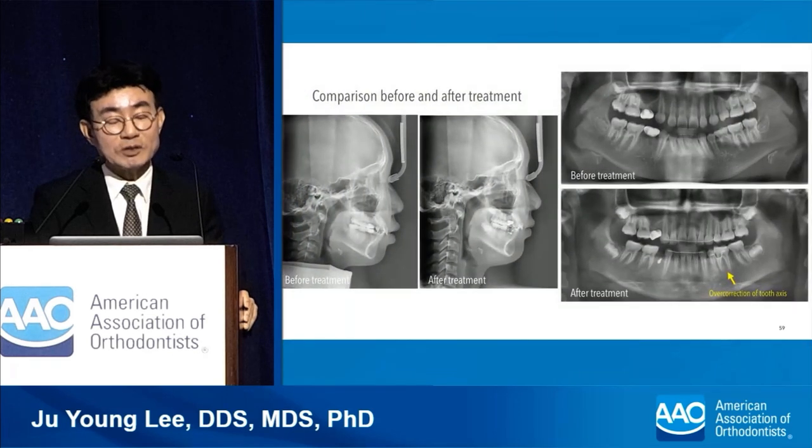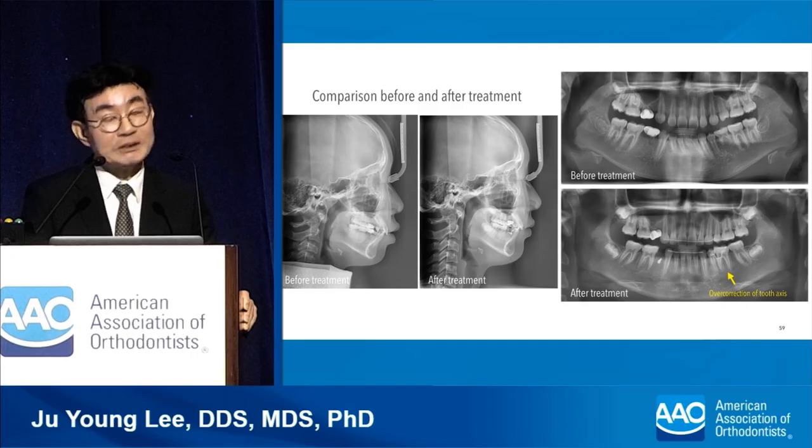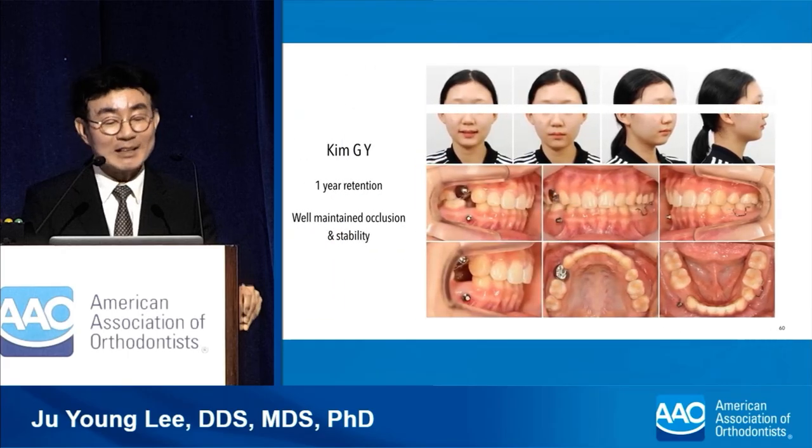Out of 6 congenitally missing teeth, the spaces for 4 missing teeth were closed, and 2 implant spaces were left on the right side. With protraction of the mandibular right teeth, teeth axis and midline of the anterior teeth improved. The midline and Class 1 occlusion was stable and well maintained at 1-year retention check.